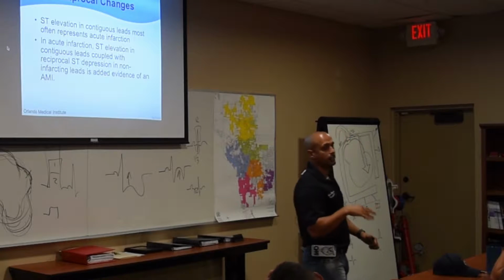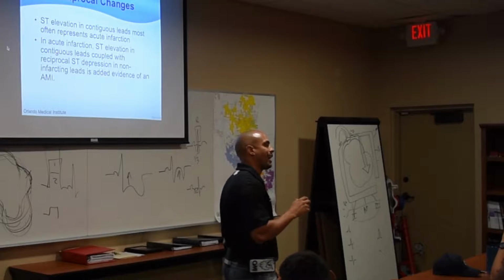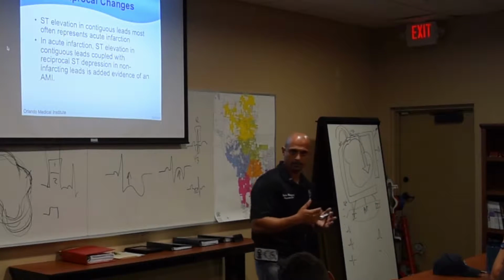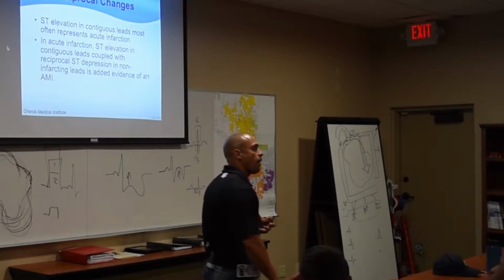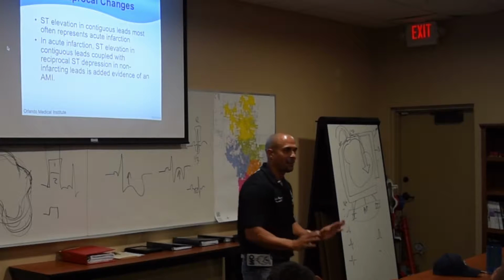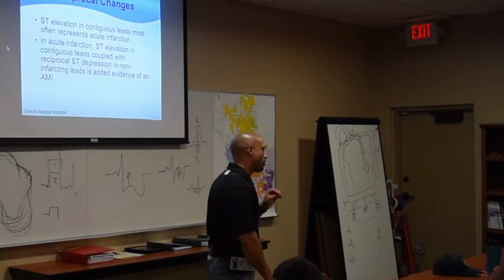Now, the next question I always get: why don't they just make a 12 lead with 18 leads? Because it takes too much money to invest. And I'm going to tell you, posterior walls account for less than 3% of all MIs. It's not that frequent. If you ever took a heart out of a cadaver, all the fat is on the anterior. The back of the heart has no fat. I don't know why, but it's all in the front. So posterior walls are very minor.